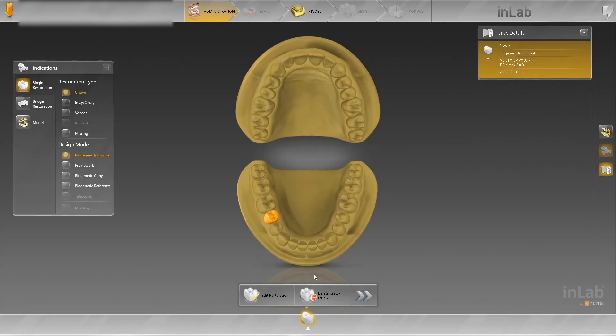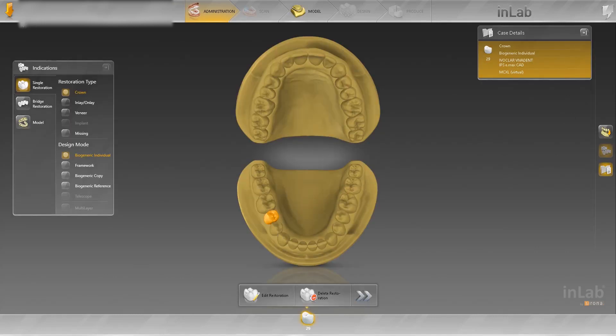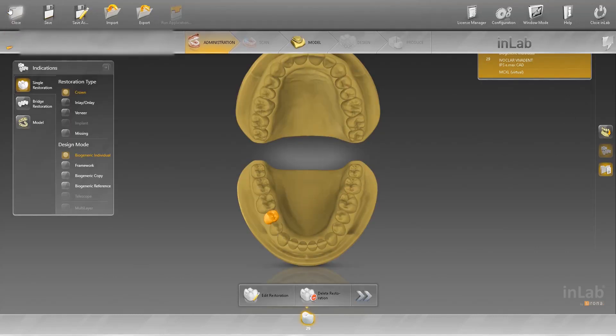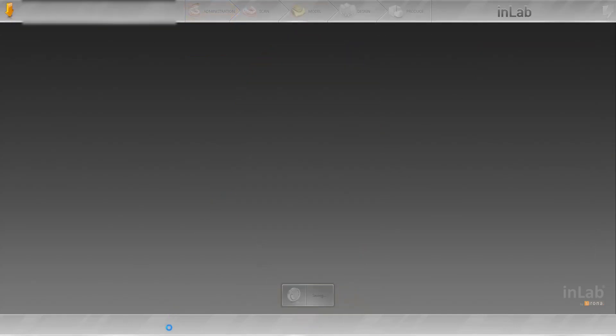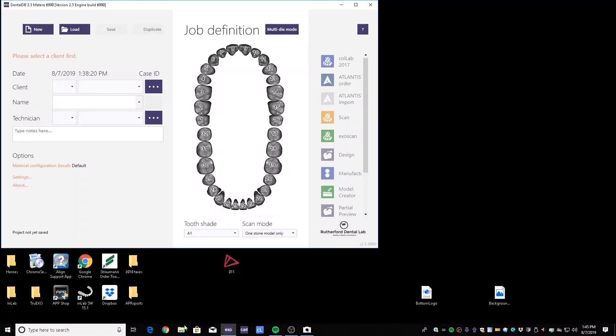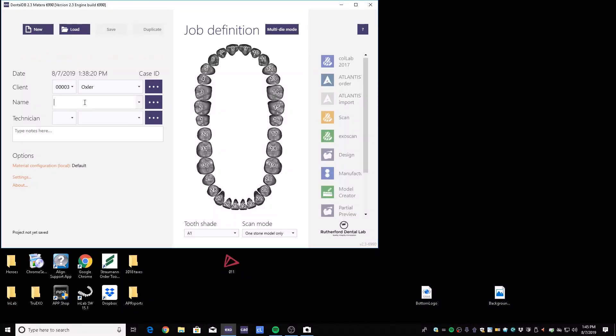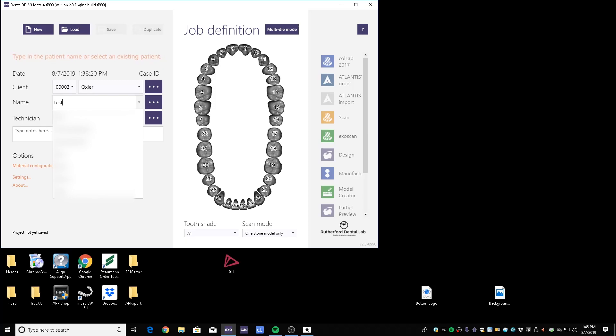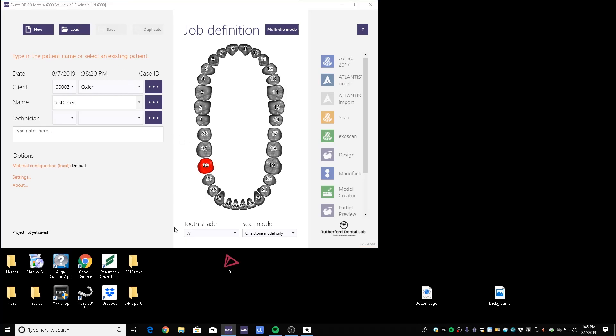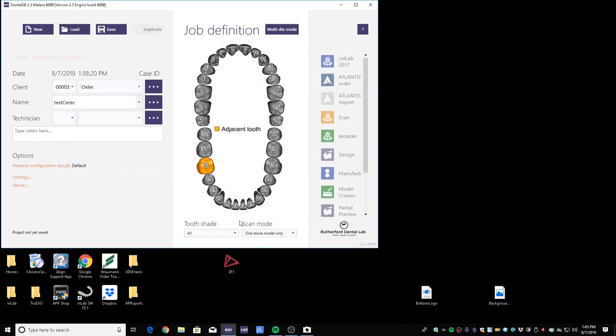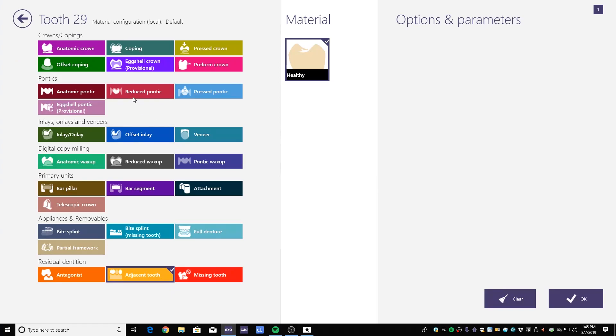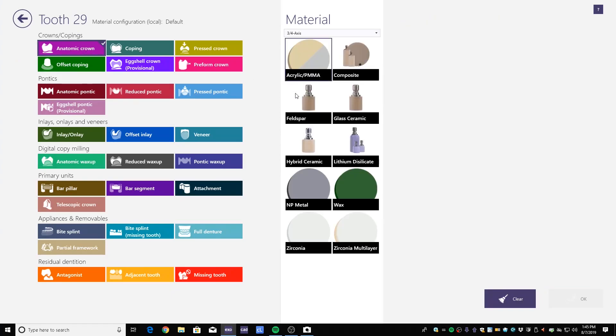Just like that your files have been exported. You can go ahead and close in-lab. We'll save and we will open up ExoCAD.